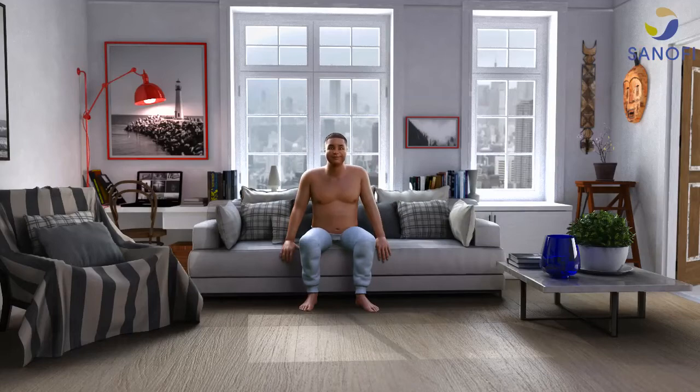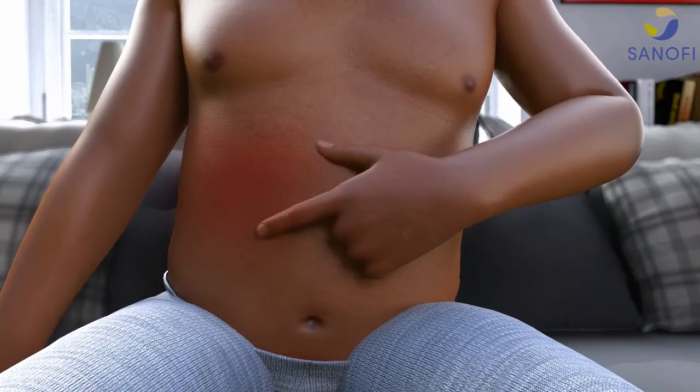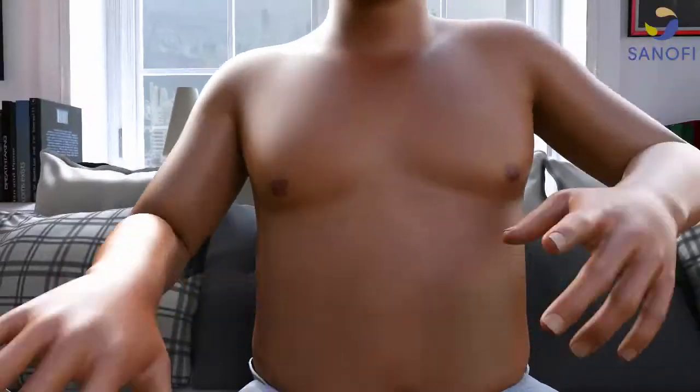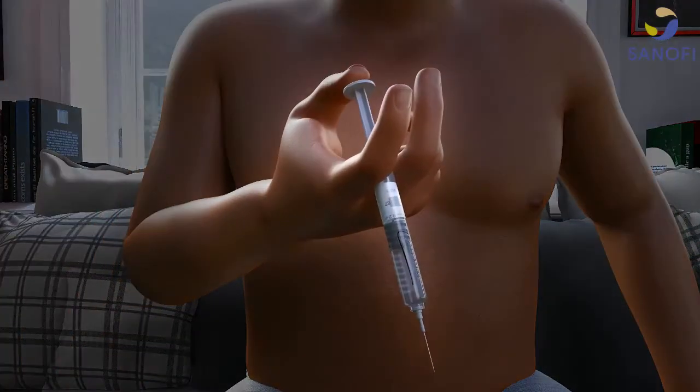Sit or lie in a comfortable position. Choose from the left or right side of the stomach, at least two inches away from the navel and out towards the side. Remove the protective cap from the end of the syringe and hold the syringe like you would a pen.